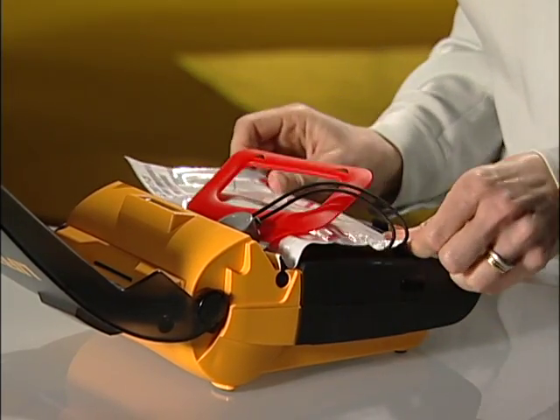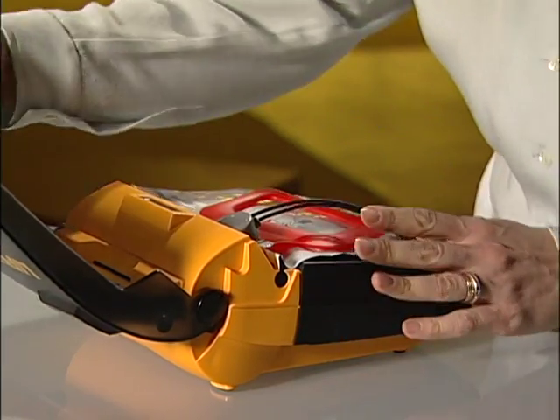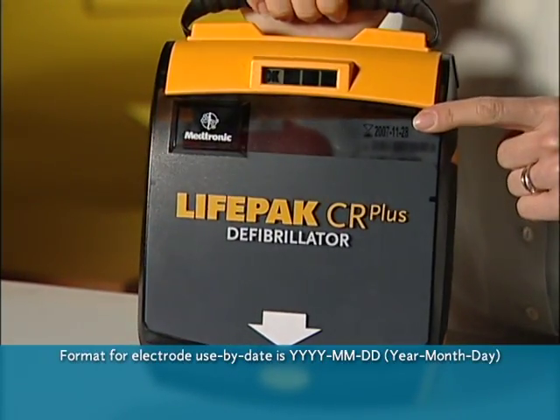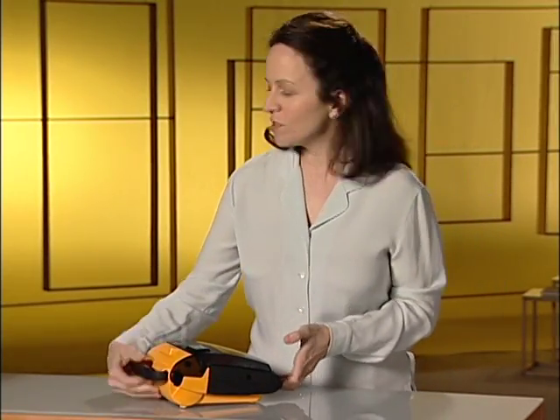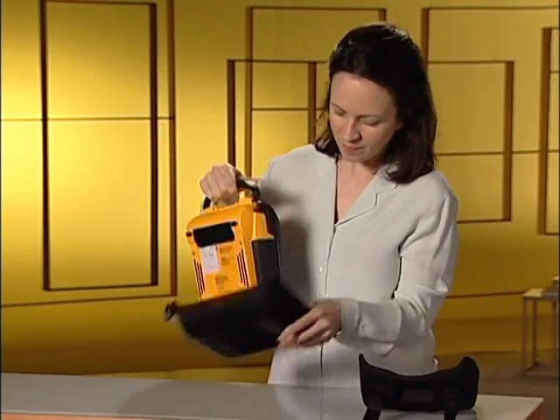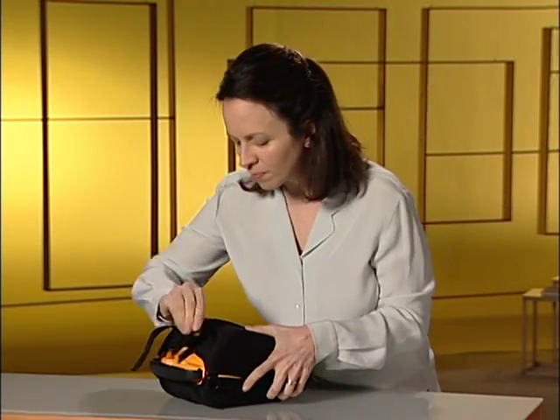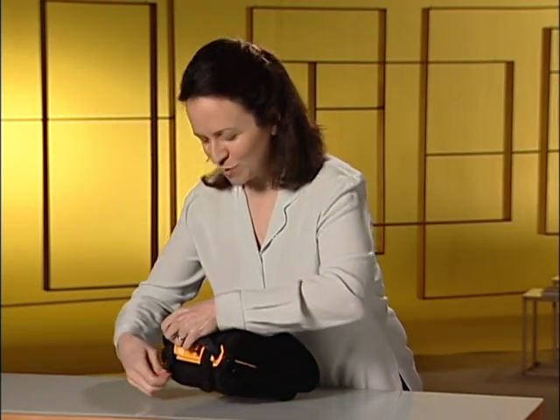Center up the package and tuck the edge under this little lip here so you can close the lid. Make sure you can see the new use-by date through this little window again. And there, all done. Some LifePAK AEDs come with a soft case. Put it on like this. It closes with these Velcro straps.